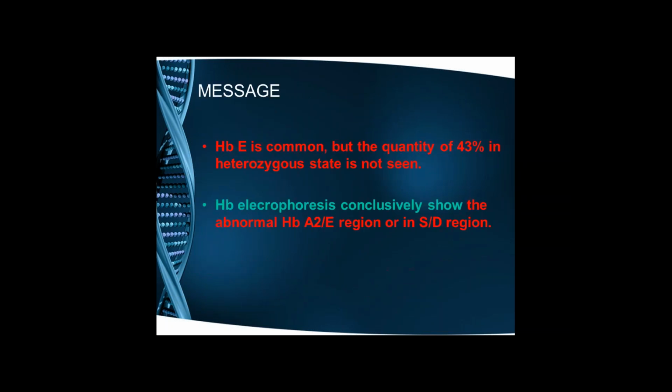Next slide. The one that I showed, sickle, yeah, here it is. As I said, HbE is common in some parts of our country, but levels of 40-45% are generally not seen.